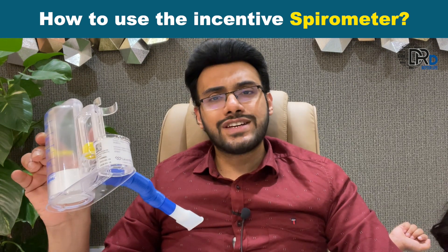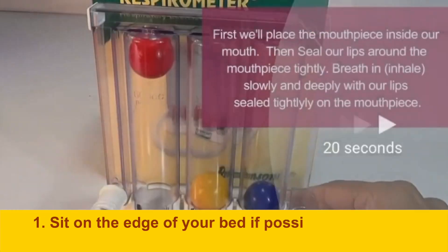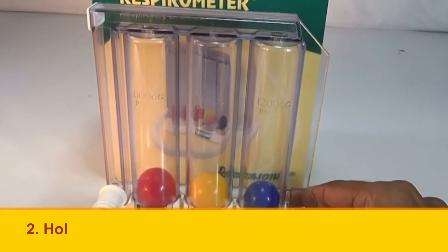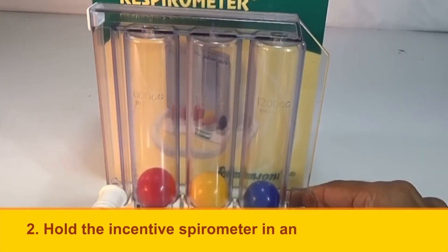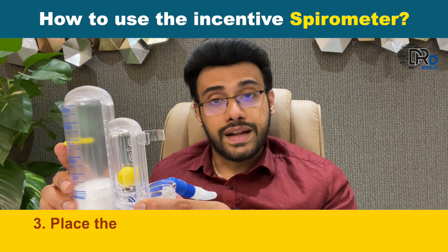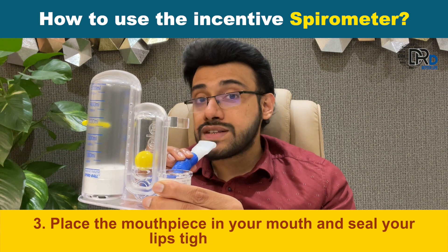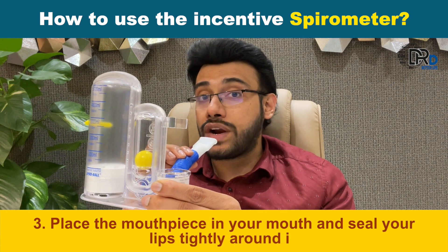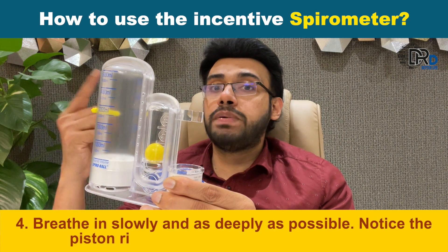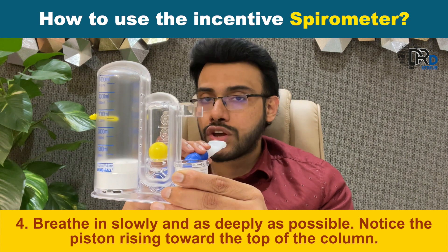How to use the incentive spirometer? First, sit on the edge of your bed if possible, or sit up as far as you can in a bed. Second, hold the incentive spirometer in an upright position. Third, place the mouthpiece in your mouth and seal your lips tightly around it. Breathe in slowly and as deeply as possible, and notice the piston rising towards the top of the column.